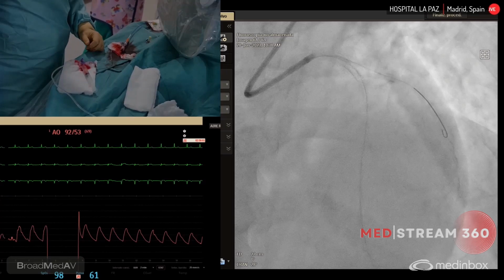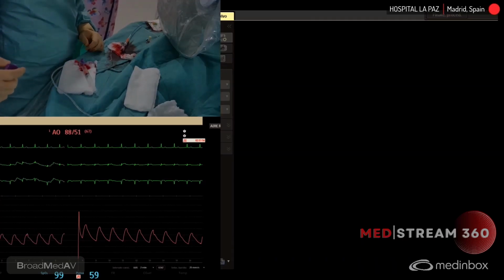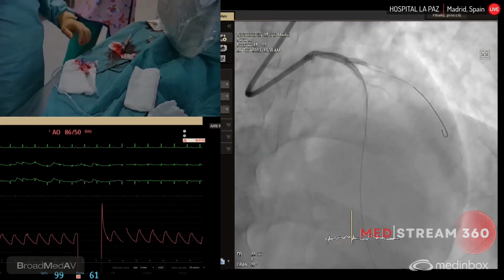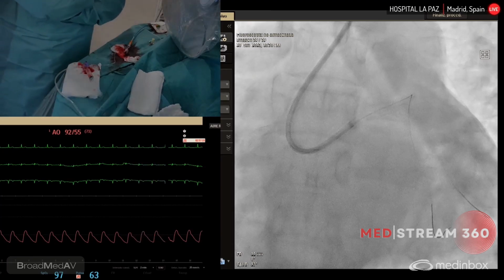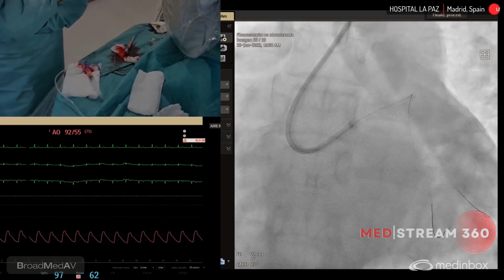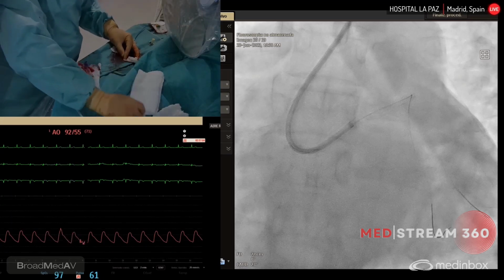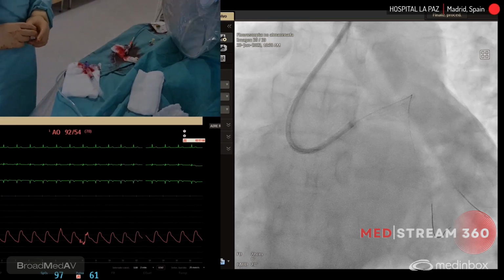Or put the B5, Borja. I think it's 4. Can we have an NC balloon 4/8? The other important part when you do a bifurcation like here is to put enough length in the proximal vessel to do the proper POT. That is at least the length of your shorter balloon. We are using a 4/8 balloon, and we have enough space there to do the POT.